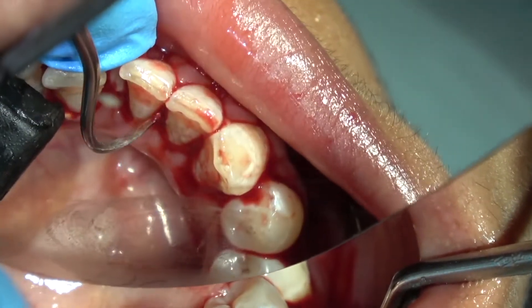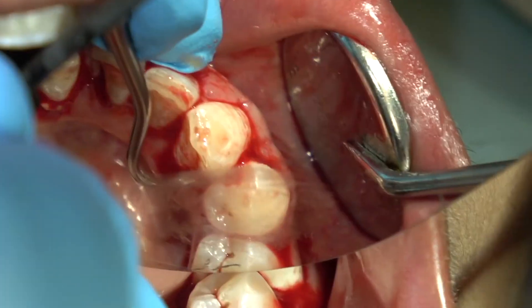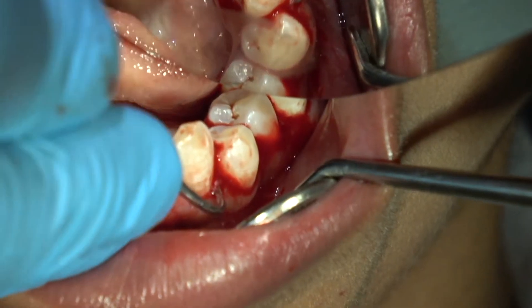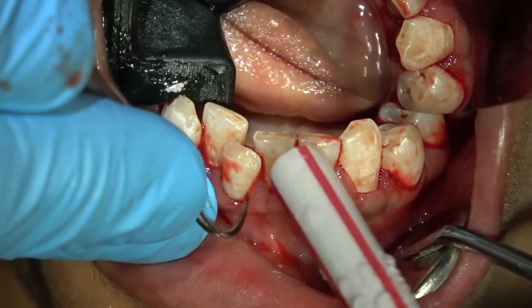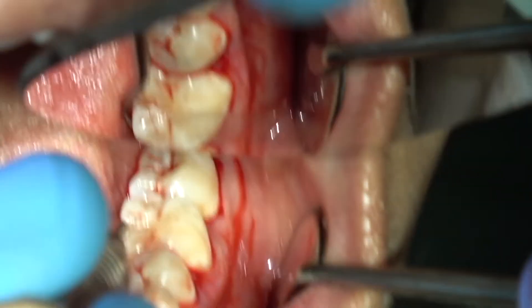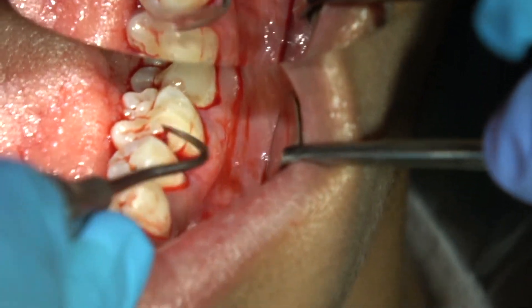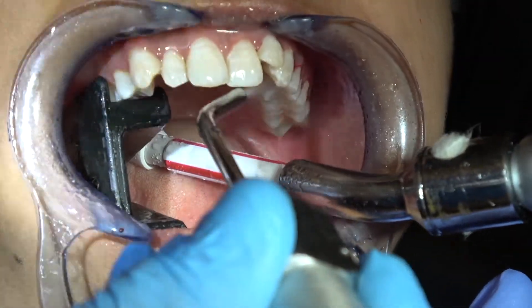Once they rinse, floss, brush, and rinse the teeth, the patient should stick their tongue out and brush it side to side, because plaque accumulates on the tongue. I'm shoe-shining in between these teeth, knowing we're going to have a lot of bleeding when we do this for the first time because those teeth have probably never been flossed.